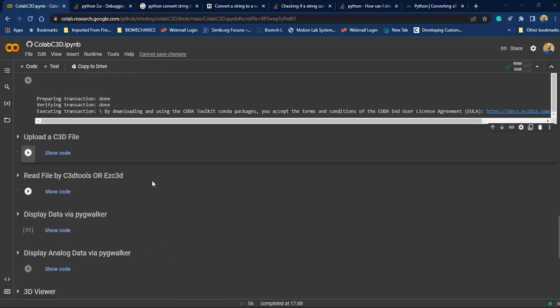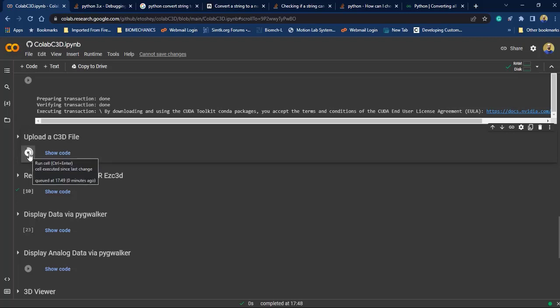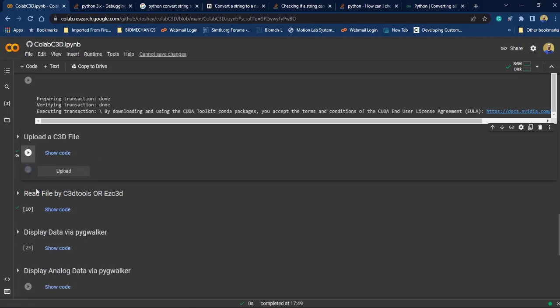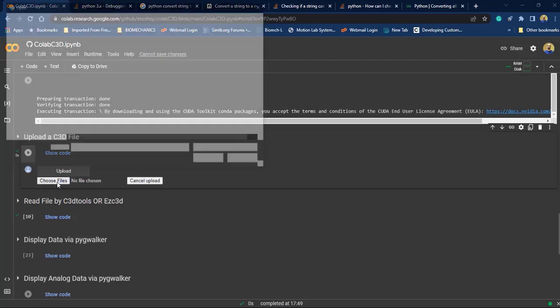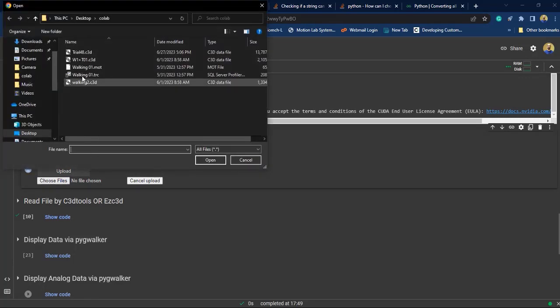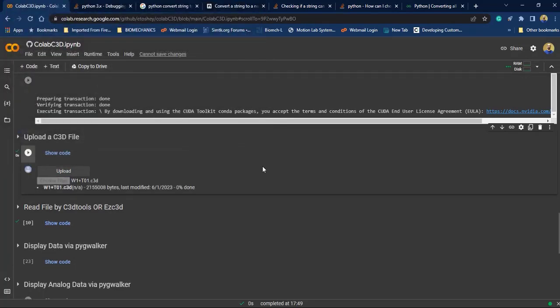Now we need to upload a C3D file. For doing that, click on this button and click on upload button and finally choose your file.